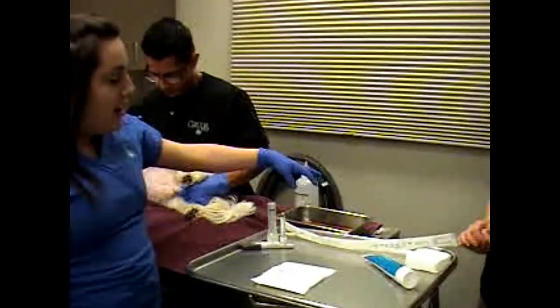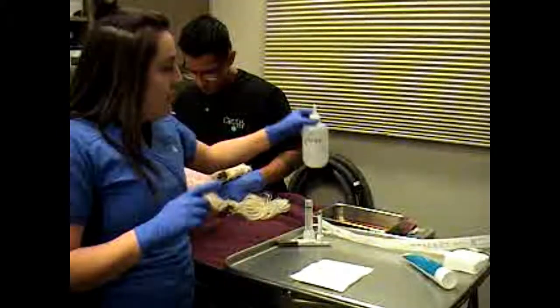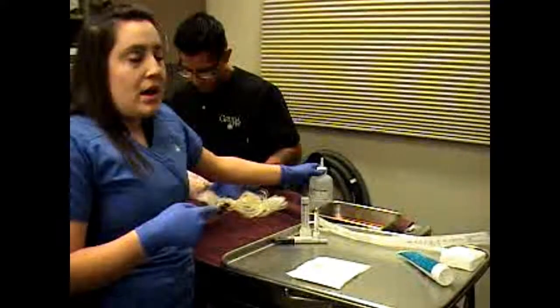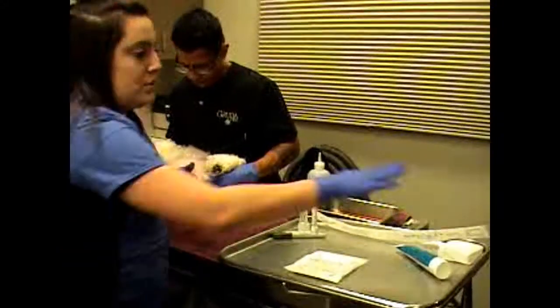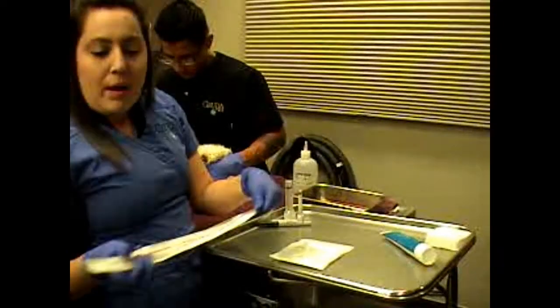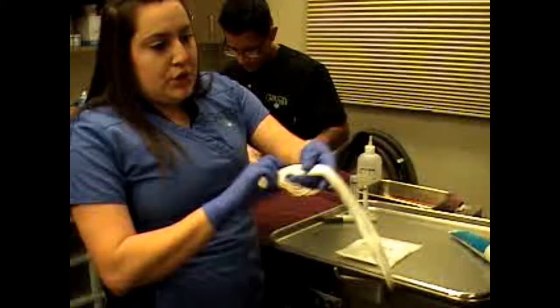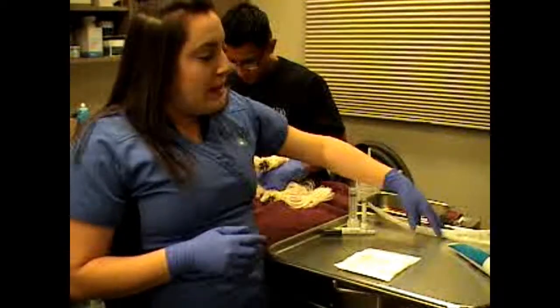So we've got a tray of diluted betadine, so that way we can cleanse the penis. And then we've got sodium chloride just to rinse after we cleanse it. So we'll do that a series of 3 times. So we've got some gauze to do that. We've got a 5 French red rubber catheter.